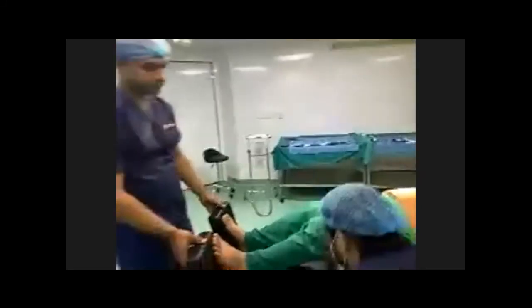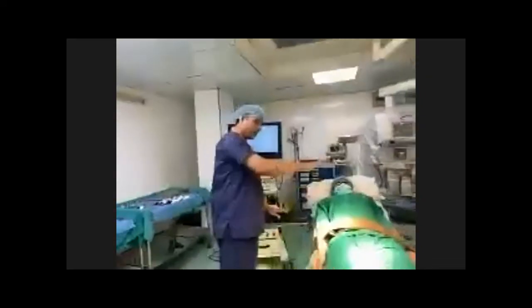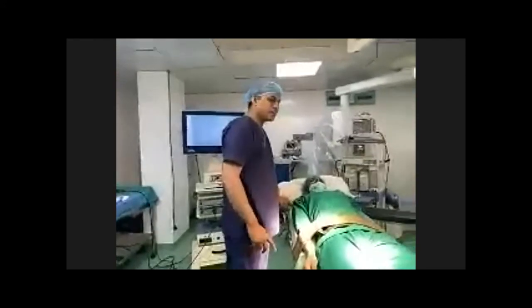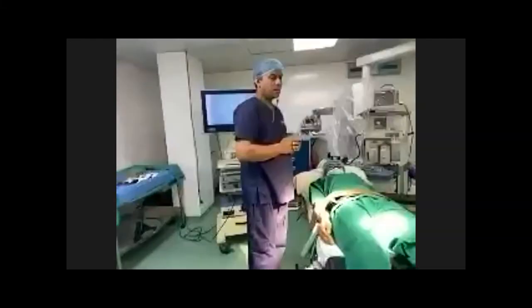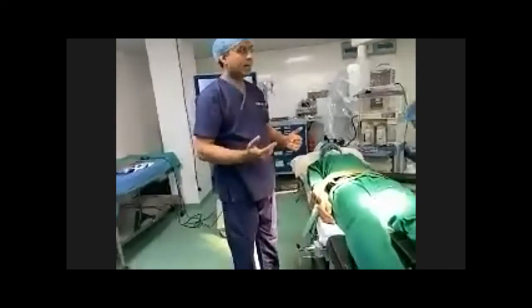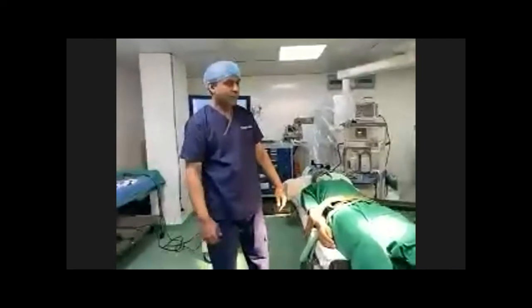We are now doing the reverse Trendelenburg position. In gynecological procedures, and if we are performing anterior resection or APR, we have to make a lithotomy position as well during laparoscopy. Lap assisted or total laparoscopic procedures, attach the poles. So we will quickly attach the poles.